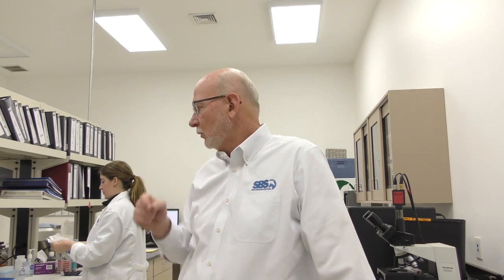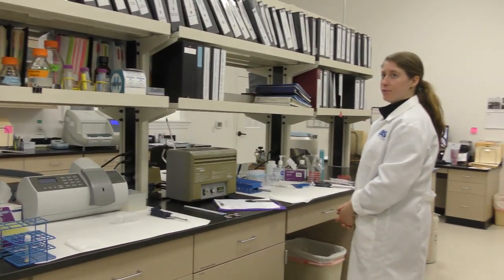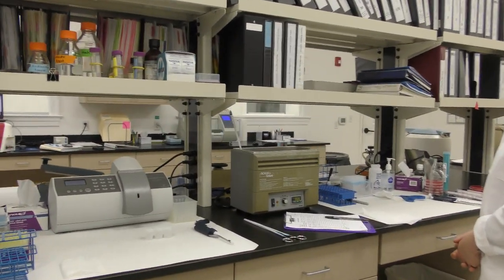We also tend to do them in batches of at least 5 at a time. I'm going to thaw 5 samples. I have no idea what they are, what the quality is going to be, and then when they hit the 30-minute incubation time, I'll do an analysis of the motility on the CASA system.